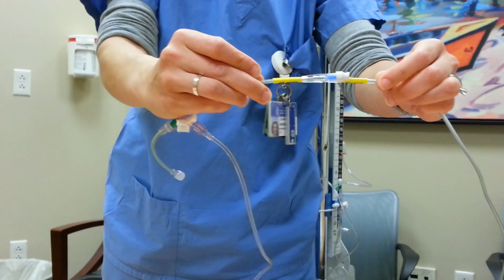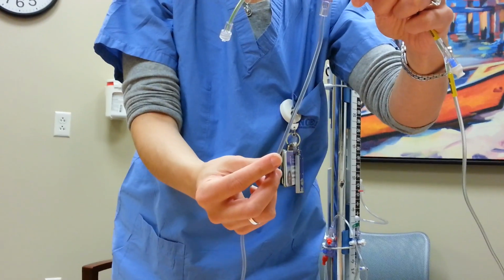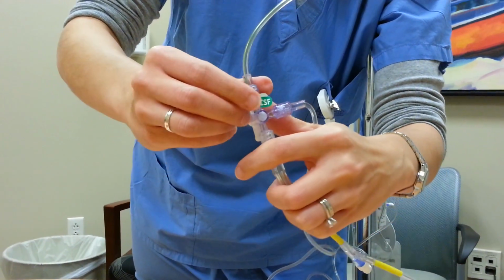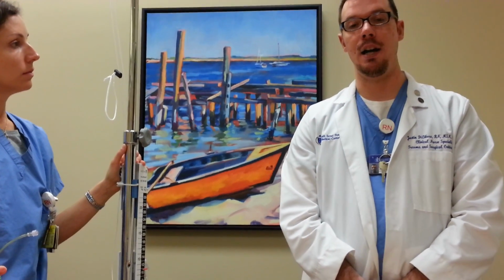One of the problems is the pressure tubing that we're using is just our standard pressure tubing, and so there's obviously no special identification of that tubing. With that in mind, we have these green CSF labels, and these should be available to you in the OR. And you want to use those at any stopcock or access point to identify these areas as CSF.